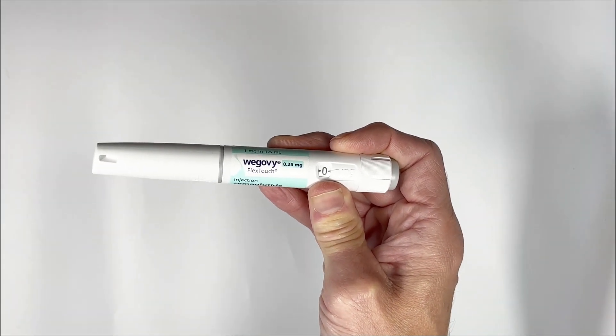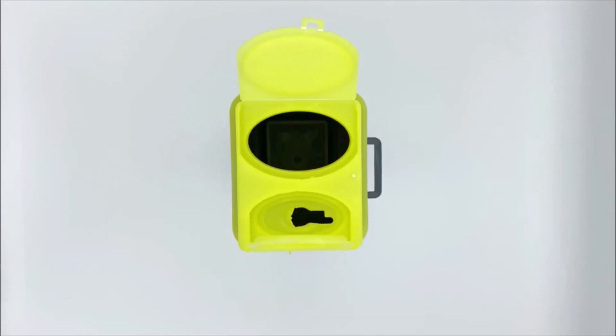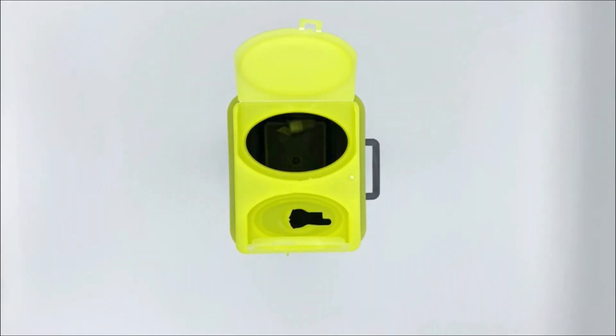If blood appears at the injection site, press lightly with a gauze pad or cotton ball and apply a plaster if desired. Throw the needle into a sharps disposal container, never in your household trash.